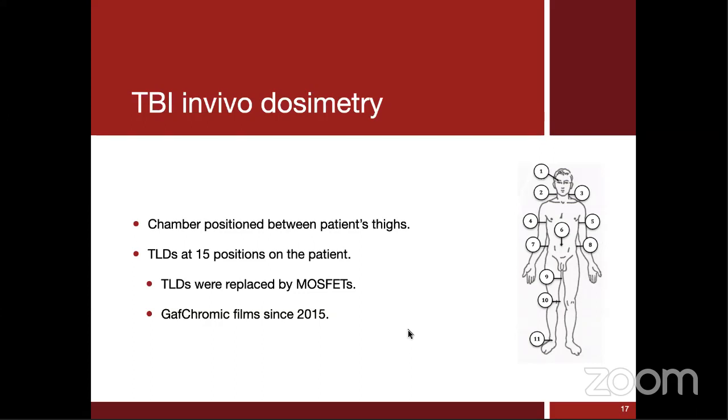But of course, we hate doing dosimetry with TLDs because they require time. You have to leave them for some time so that the low-temperature peaks fade at room temperature and don't affect the dosimetry. So we switched to MOSFETs, where we get the reading on the spot. But then, unfortunately, something happened to our MOSFET kits, they got damaged, and we were stuck. So we had to come up with a different in vivo dosimeter. And what do we have?